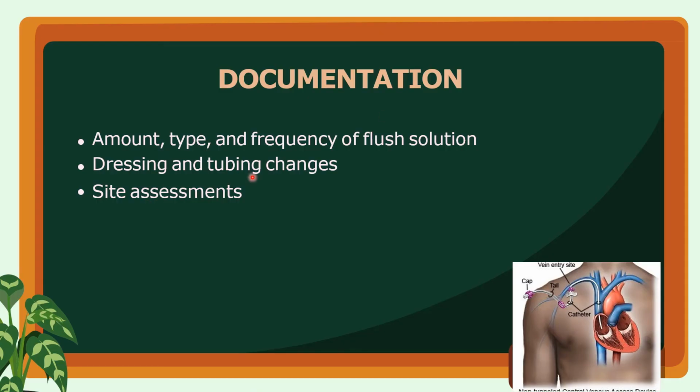Now, after doing the procedure, of course, it is important to document your procedure. So include in your documentation the amount, the type, and the frequency of flush solution, the type of dressing and the tubing changes, and your assessment of the sites.